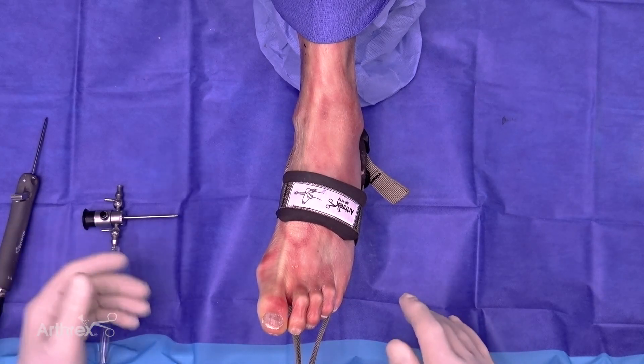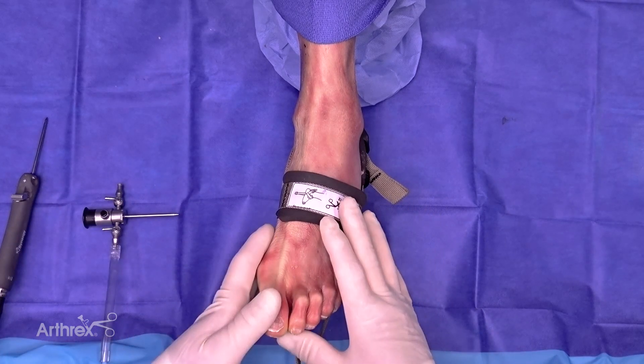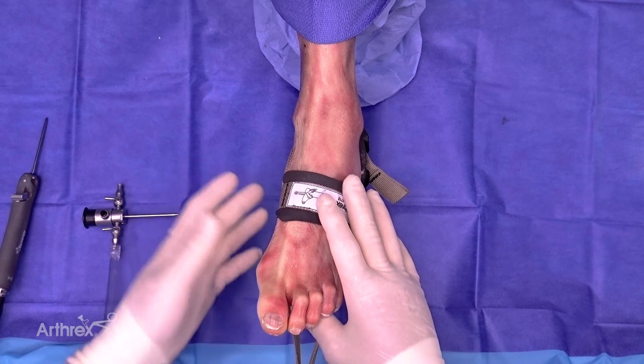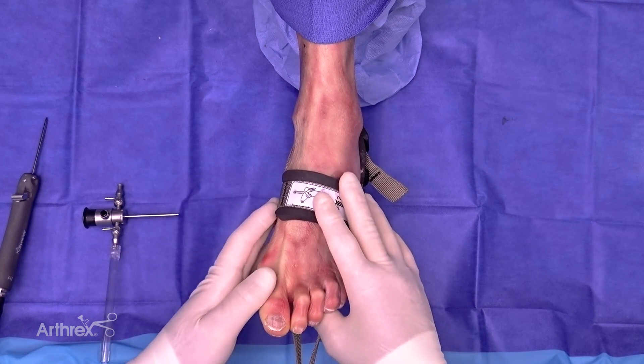Hi, I'm Dr. Carl Hussman. I'm from the University of Pittsburgh in Pittsburgh, Pennsylvania. What we're going to do is go over ankle arthroscopy with the use of the Arthrex SJ50 Apollo Probe.